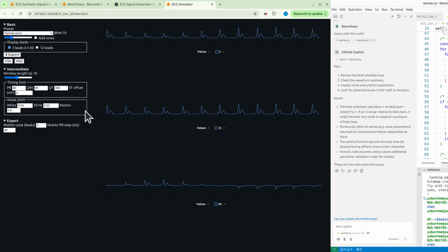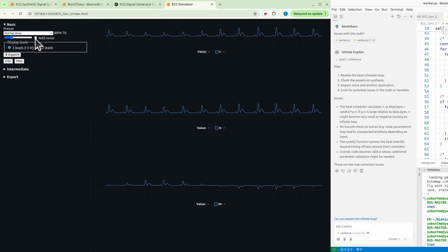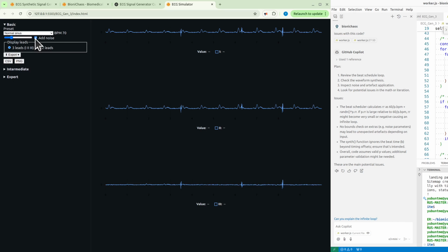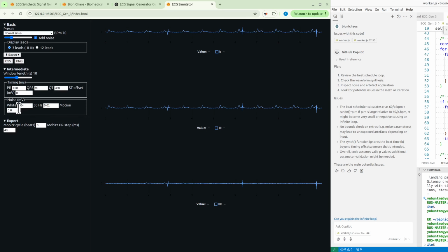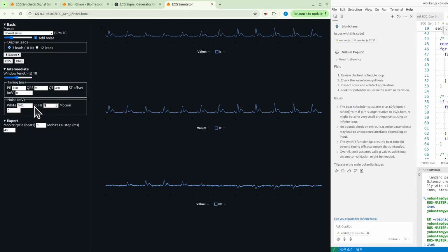Obviously we need more testing, and I don't know why the noise is making things so much worse. You wouldn't expect it. Actually, noise can reduce it. You can just add a bit of white noise to make it look more realistic. Yeah, the view is not great. It could have been much larger.